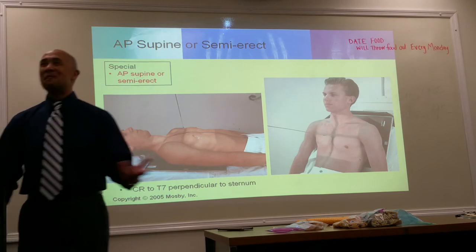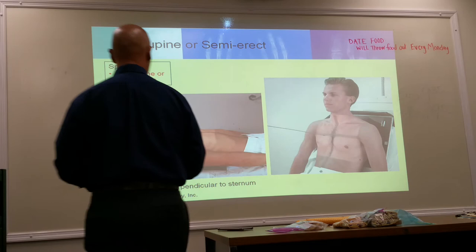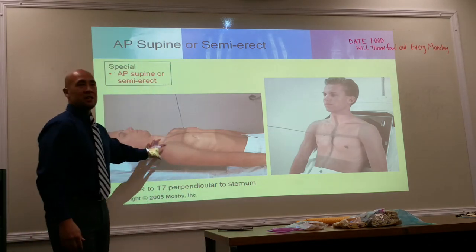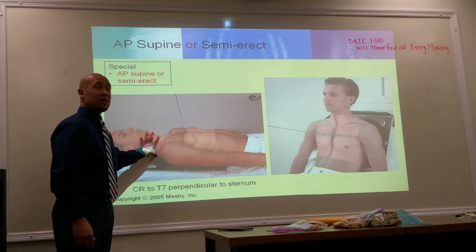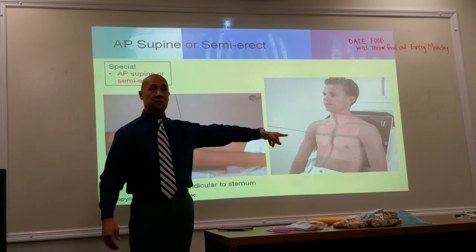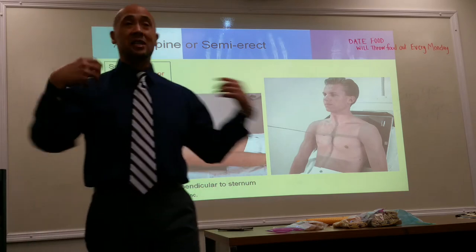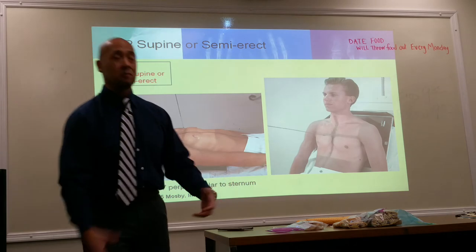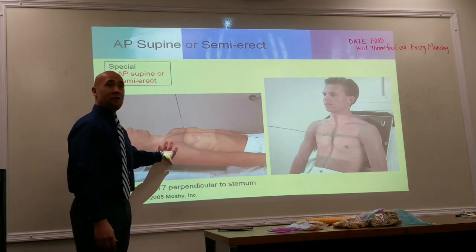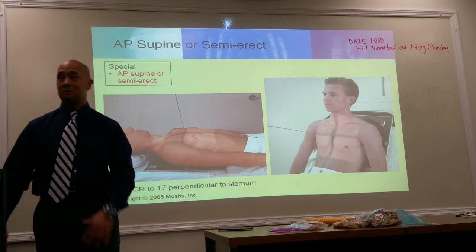All right. AP supine or AP semi-erect. Okay. We try to avoid this at all costs because, again, the vessels become engorged and you can't see fluid levels. So this would be a better way of doing this. But if your patient's in ICU, they've got lines sticking out of all their arms and their neck, and they're being assisted with some kind of respirator, so you can't move them around. So you have to do a supine.